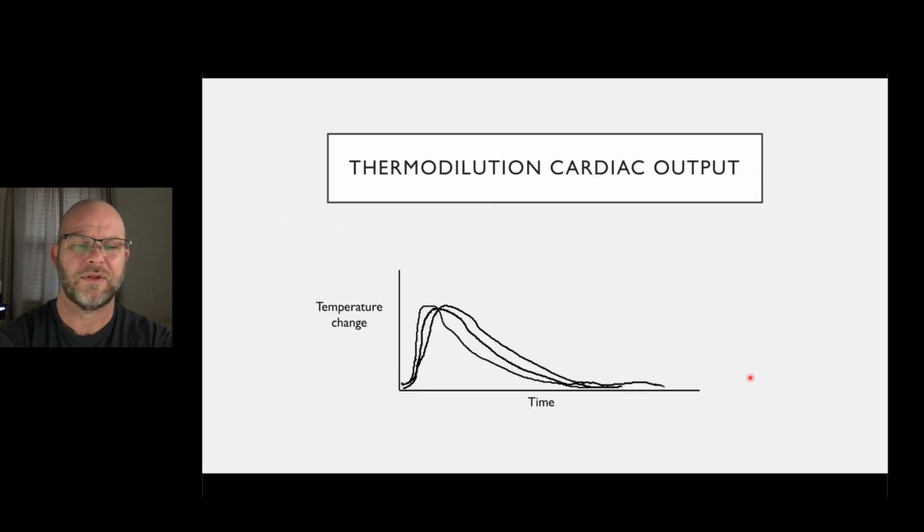And then finally, one of the other things that you'll get from this is your thermal dilution cardiac output. This is done with that proximal injectate port. You'll hook up the thermistor cable that hooks to your Swan to a thermometer measuring the temperature of the saline in the room you're in. Then that'll hook up to your temperature port on your monitor. When they inject, you'll see this deviation of temperature, and then you'll see it slowly return.